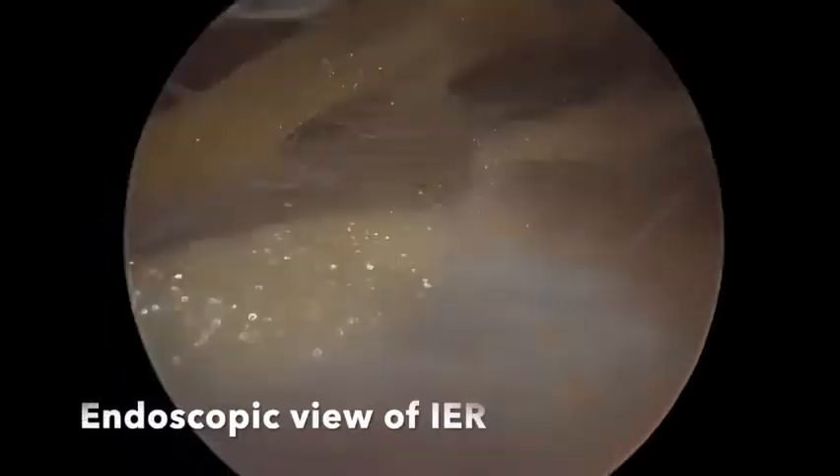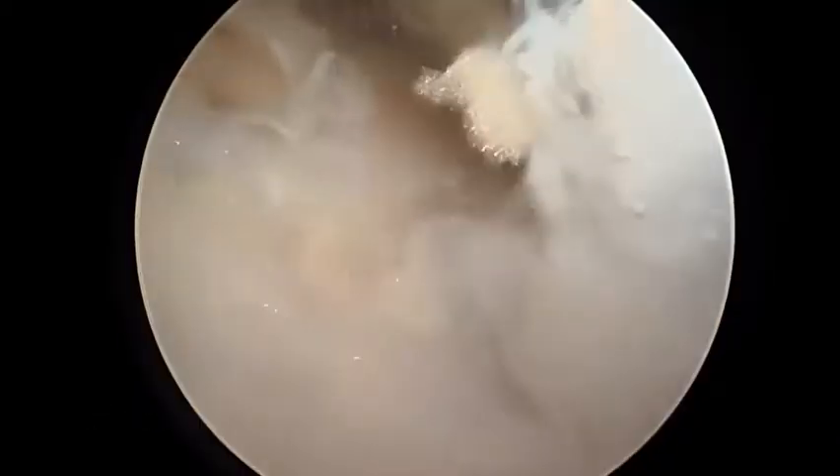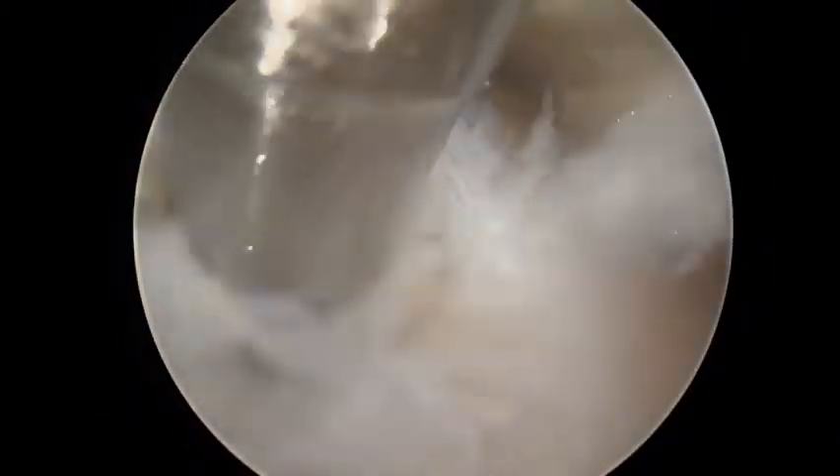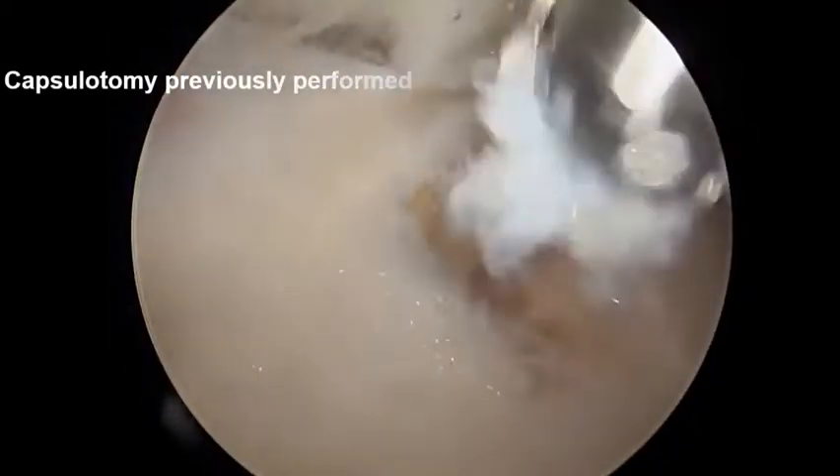Using the endoscopic lateral portal, the inferior retinaculum can be identified and dissection continued. The capsulotomy performed before can now be seen endoscopically and will serve as a reference.